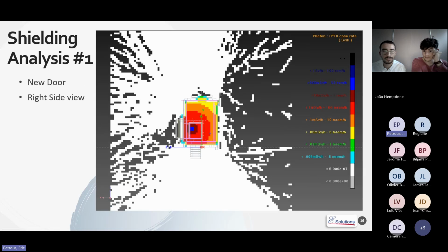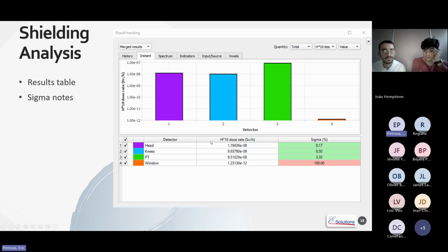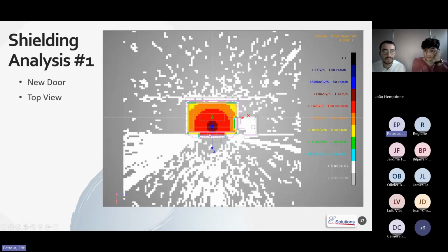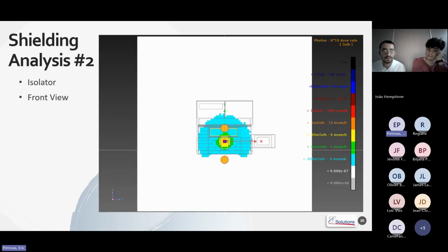We got a few more views of them, as you can see where the source would be right in the middle in that dark blue spot. And according to this picture, that door is working quite well at keeping all the radiation away from our user. And here you can see some of the results from this. It may look like the window is bad because it's got this really bad sigma, but that's just because it wasn't getting much data, so it thought there was an error. But as the heat maps show, there's just no radiation that's even touching that detector that would be in that position.